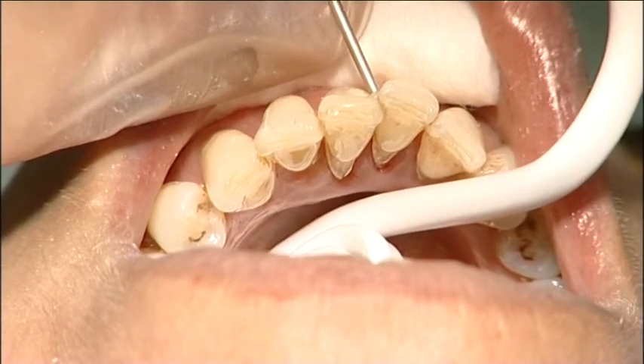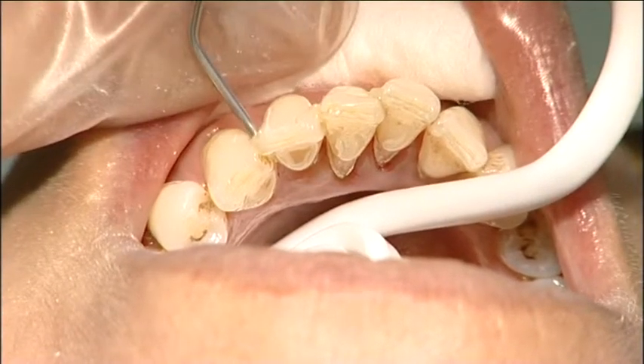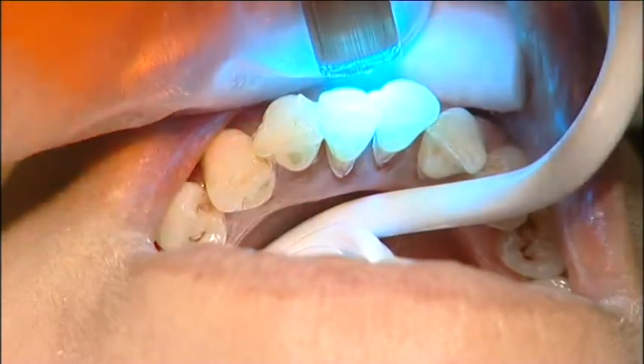First, the teeth were bonded together only with composite from the labial side in order to keep them in place during splinting. The composite was light cured.